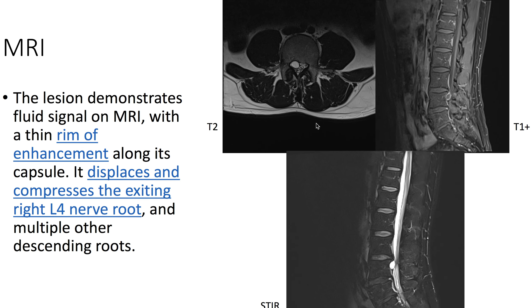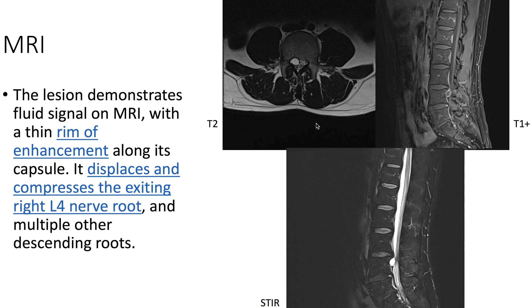On MRI, here T2-weighted imaging, we see that the lesion demonstrates fluid signal. On T1-weighted imaging with contrast, we see a thin rim of enhancement. The lesion also displaces and compresses the exiting right L4 nerve root, as well as multiple other descending nerve roots.